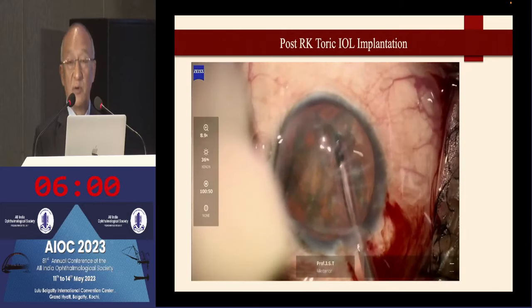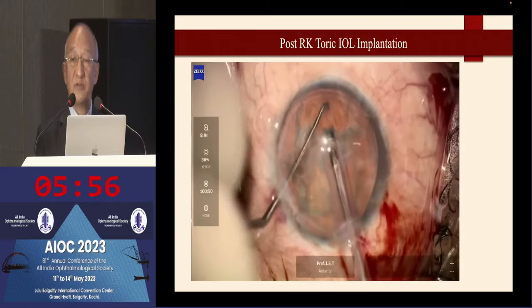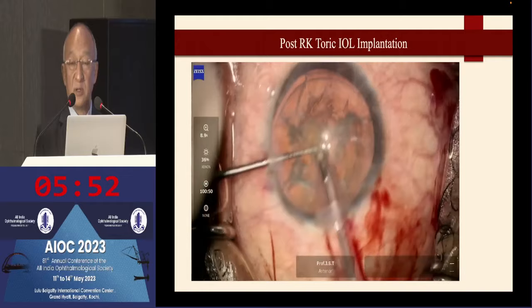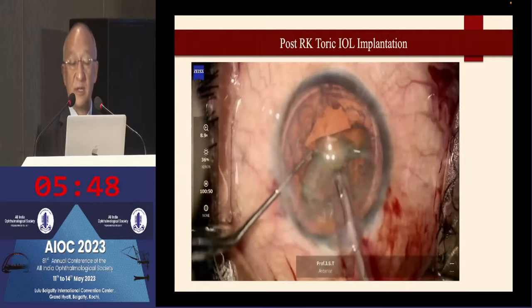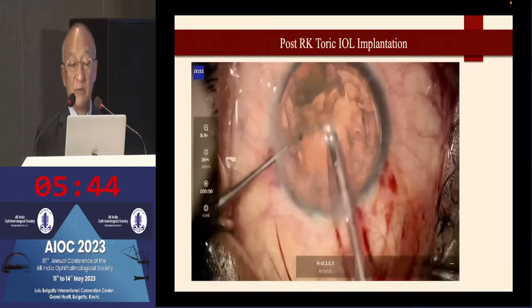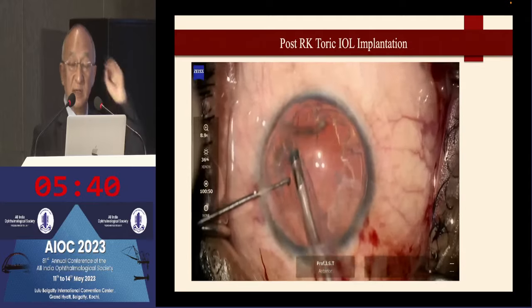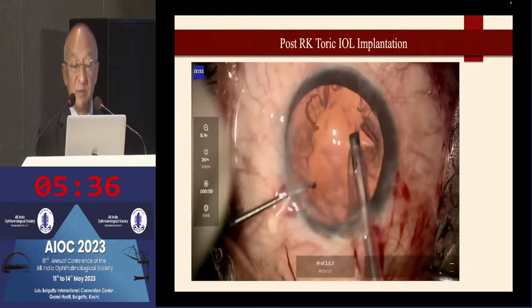That is always important. Whenever you are doing a chop technique, it's always better to do multiple chops in the intact bag. If you remove one chunk of a nucleus, then subsequent chopping can sometimes be difficult. So this is a flipping technique of a nucleus where you can emulsify subsequently without any difficulty, especially in harder cataracts. Flip does work in separation of multiple pieces here.